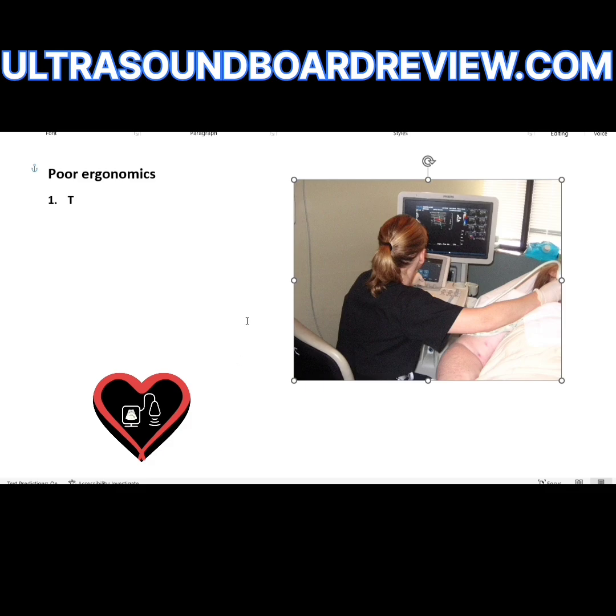What's the obvious thing we need to fix right away? Number one, we need to lower the bed to the level of the hip. Is the monitor okay? I don't see her head kinked down or up — I think she's looking straight at it. She could probably move the machine over a little bit and bring the monitor over, but she's probably using a machine that doesn't have that capability. In a perfect world, you'd bring the monitor over so she's looking towards the window. So move the monitor to the right.